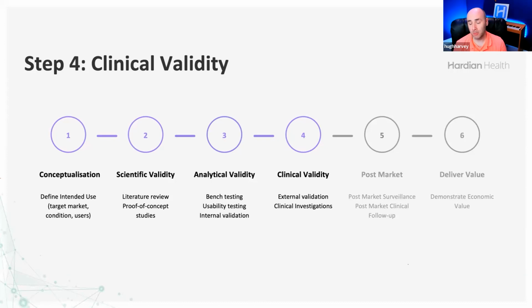They do not want people to start testing medical devices that have no scientific validity or technical documentation on human studies, human subjects. So there is a whole bunch of documentation. It will become clearer throughout this webinar, but we're only covering half of the documentation in this webinar on the clinical side. For the technical documentation, you'll have to refer back to the regulatory webinar.